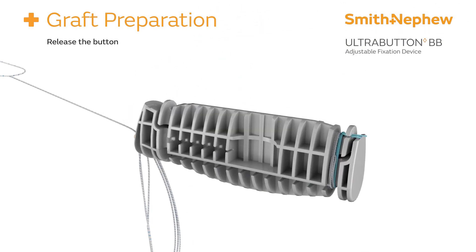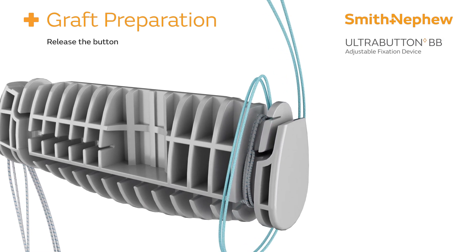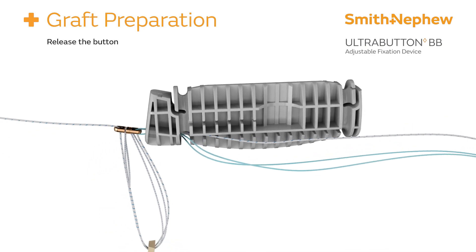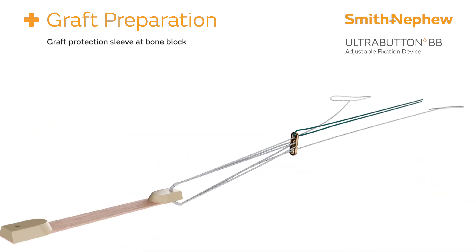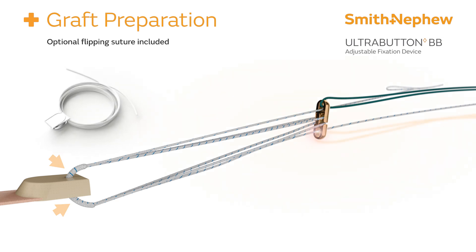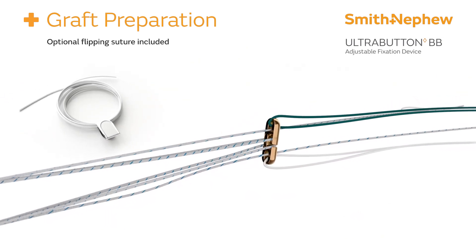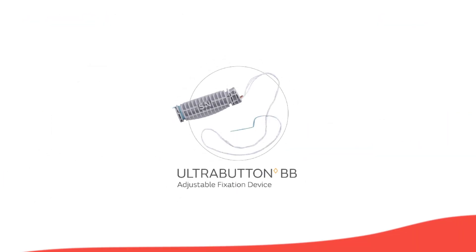Release the button from the reduction bar by unwinding the remaining green and co-braid sutures. The Ultra Button BB is now fully assembled, leaving the graft protection sleeve at the bone block-button interface. An optional white flipping suture is included and may be added to the button in the hole furthest from the green shuttling suture.